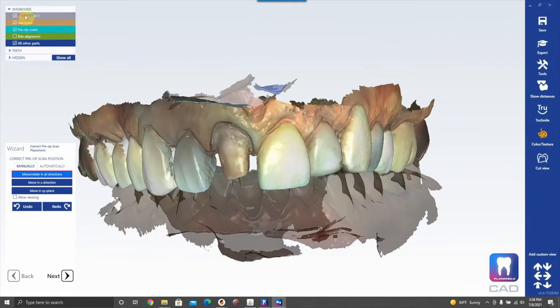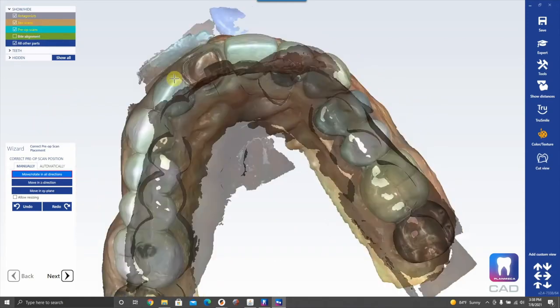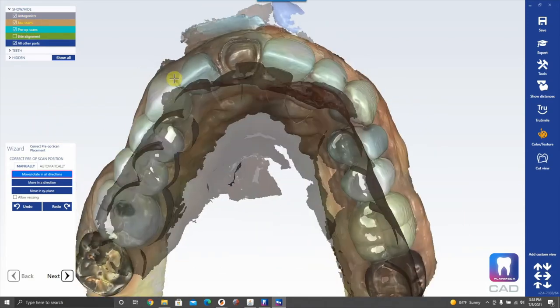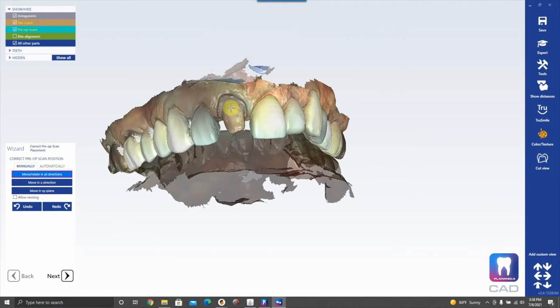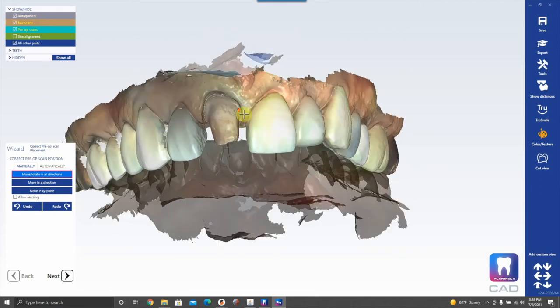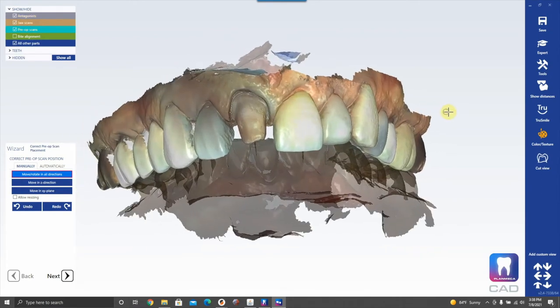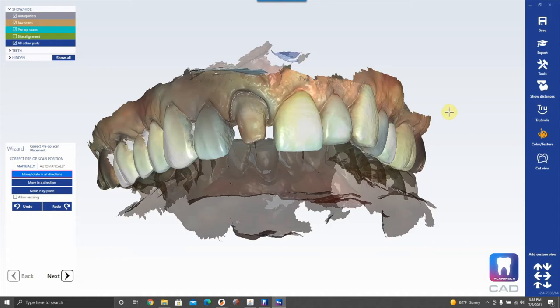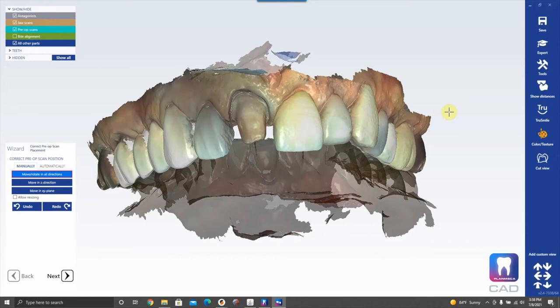Look up here — we have antagonist jaw, pre-op, and bite alignment: basically all the stuff scanned in Emerald S. Here are some keyboard shortcuts to view things quickly: press P to toggle pre-op visibility. You can see it come on and it is aligned appropriately.